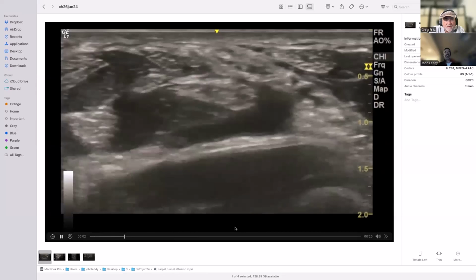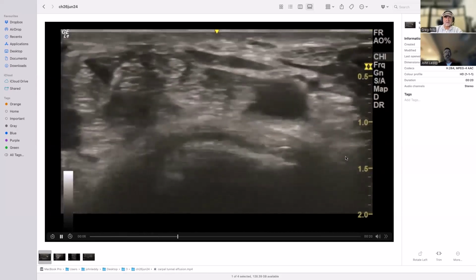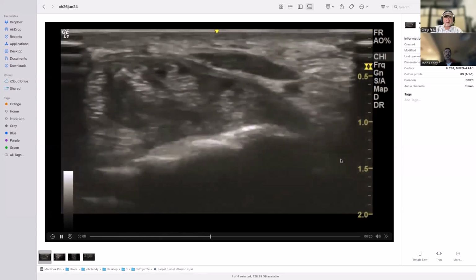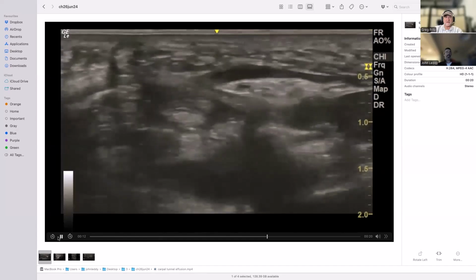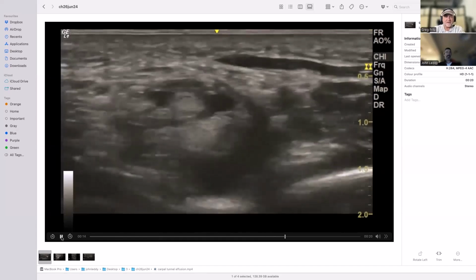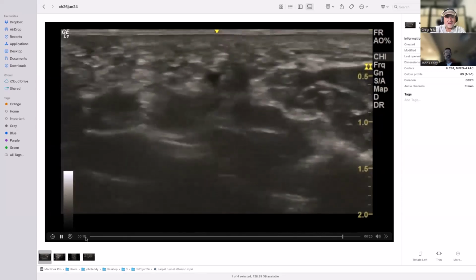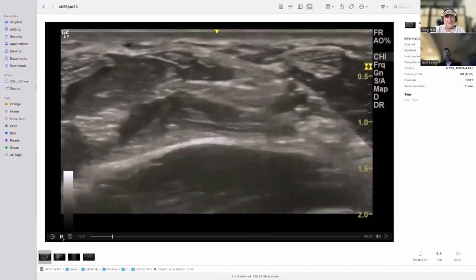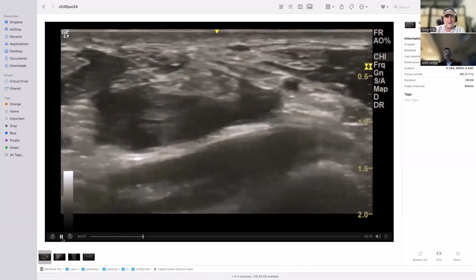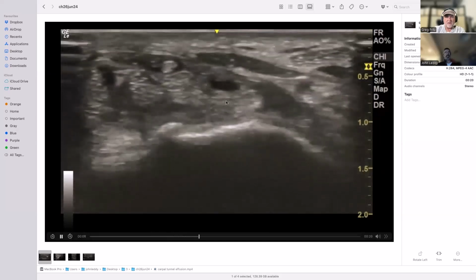I had to look at this twice because I didn't read what it was before I saw what it was that I'd captured. So this was dorsal hand? This is ventral hand. This is palmar hand. So let's just run that through again, see what you think. Go on, let's run it again. This is the hand. And these are the flexor.